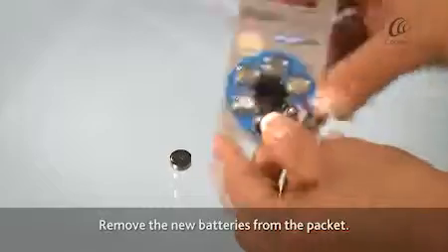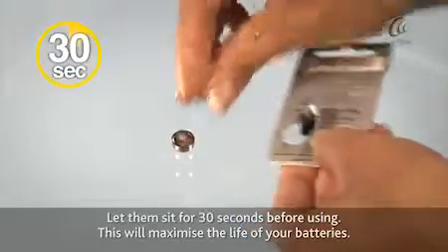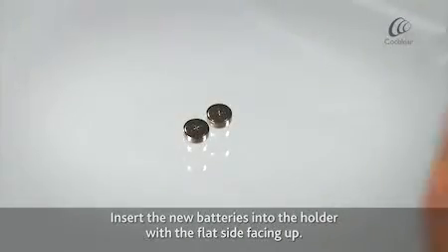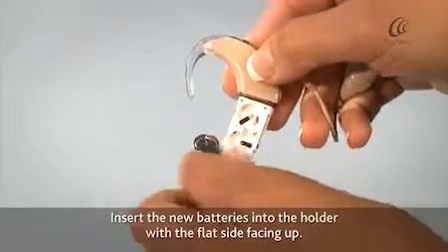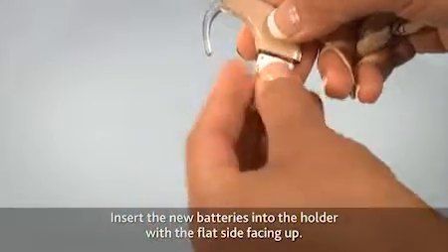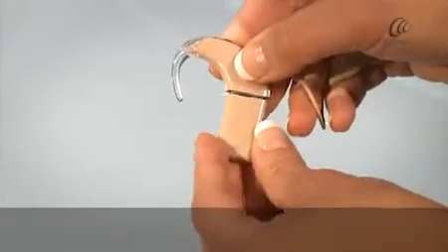Remove the new batteries from the packet and let sit for 30 seconds. This will maximise the life of your batteries. Insert the new batteries into the holder with the flat side facing up. Replace the battery cover.